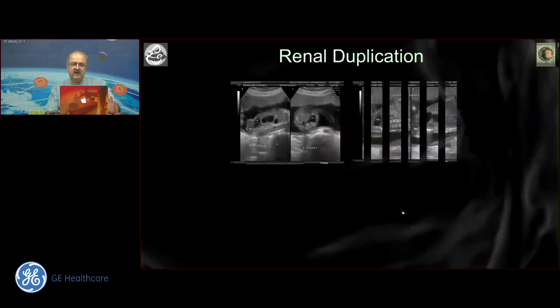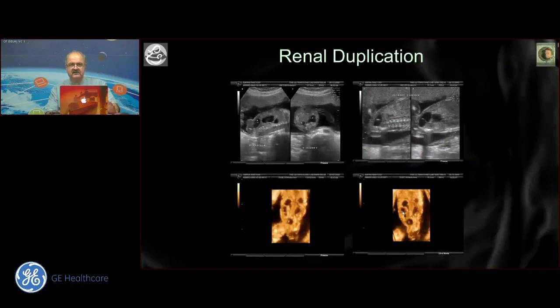When it comes to looking at cystic spaces that you're not sure of, like in this particular one, cystic spaces in the renal fossa, cystic spaces below the renal fossa, a cystic space in the bladder, and within the bladder another cystic space, it might become a little difficult to sort out. The best thing in that situation is to run a 3D acquisition in one of those long coronal planes in the posterior part of the fetus, and everything stands out instantly because we have inherent contrastiness without using radiological contrast in the fetus. And this is how it works.